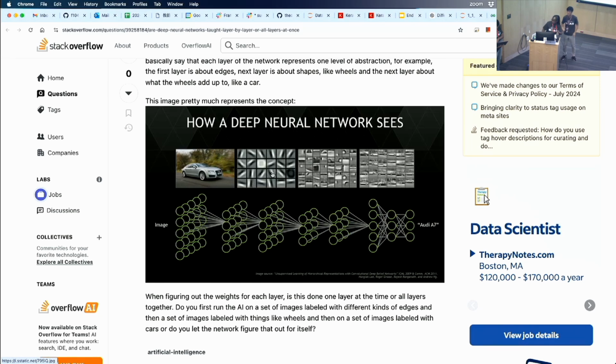So this is you're loading images, right? And you are trying to predict an Audi car, right? And you don't tell the model what are the features of an Audi car. It has to figure it out, right? And I like to explain this as like going to climb a mountain and then coming back, and you have the truth and what's incorrect, right?